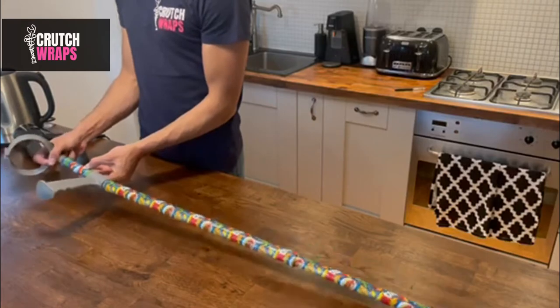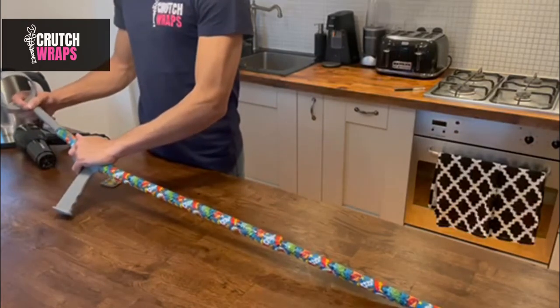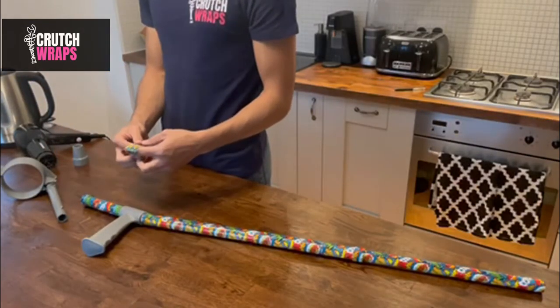Bring back the piece you just cut off and slide it down to the handle. After that, put in your armrest to the preferred notch, then slide up the piece of the wrap you just put in up to the plastic part of the armrest and shrink it on.